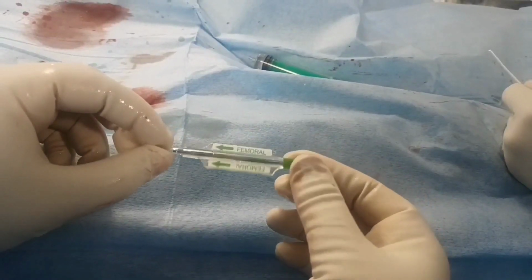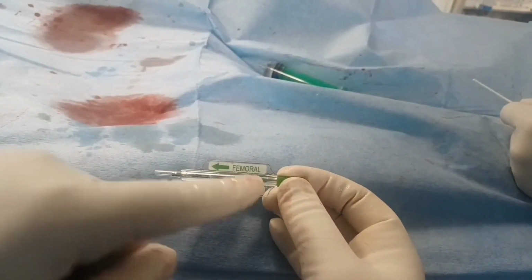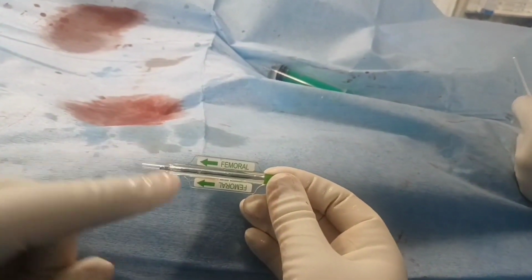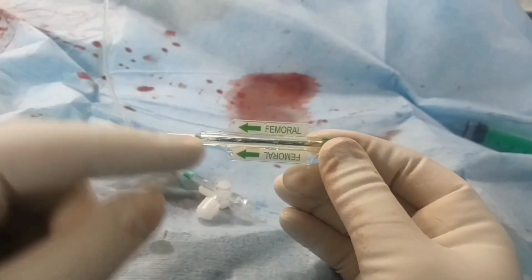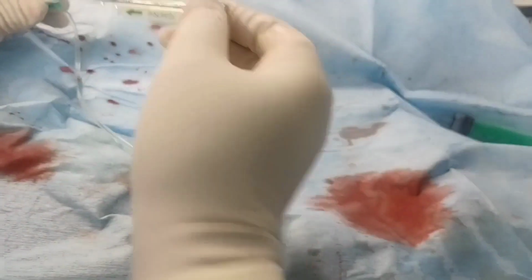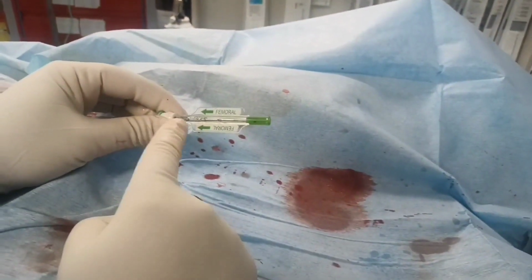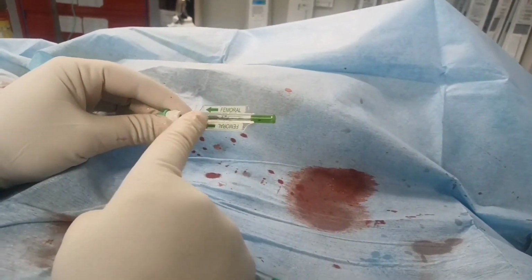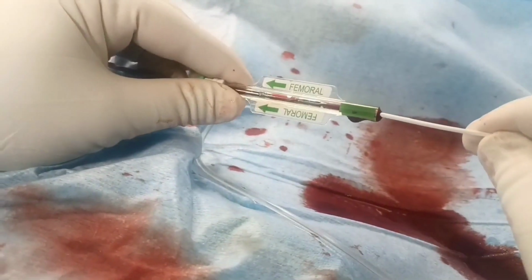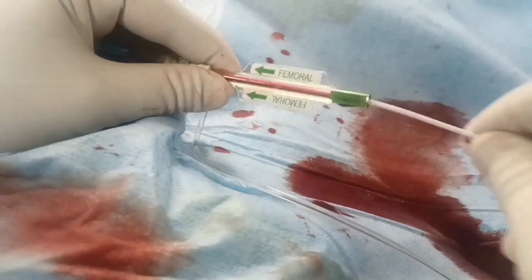There are various types of IVC filters available on the market. If the filter is to be placed via the femoral vein, we will proceed according to the direction of the arrow marked on the device. To do this, we place the IVC filter device into the distal end of the sheath at the part indicated by the arrow. And as you can see, as soon as it enters the sheath, blood enters the device. We insert the delivery catheter into the device from the end, hold it firmly with the other hand, and then push it until it reaches the end of the sheath, right?